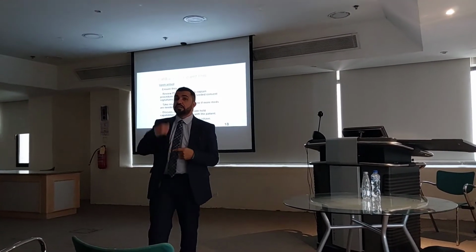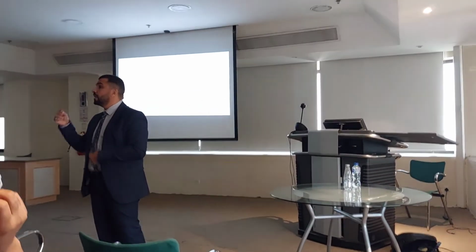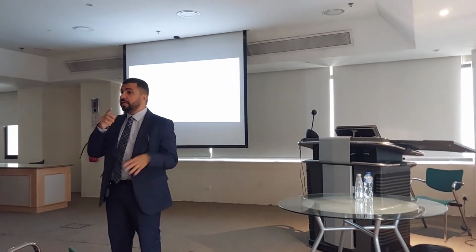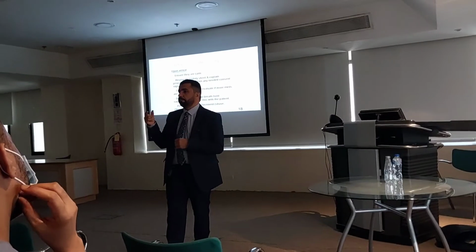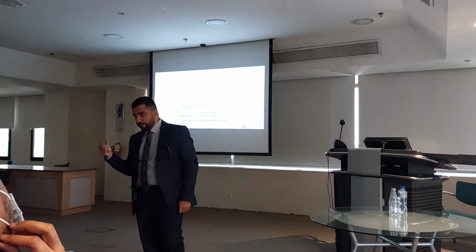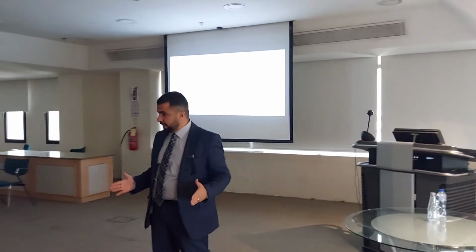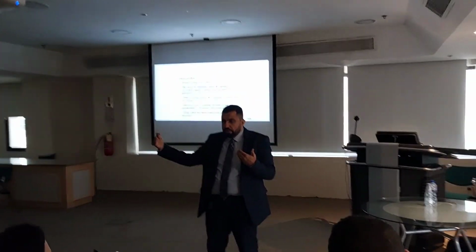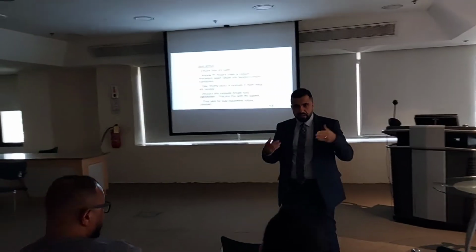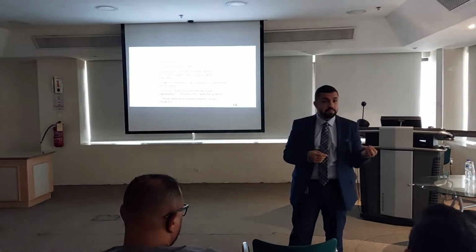This means shaving if he is male. This means I will clean the skin, if I have the proper gel to clean. The brand name is Clean Prep. Usually it comes with the machine, with the ECG kit. This is not for fun, this is not extra. It is paid for, they supply it with the machine because it's very important.